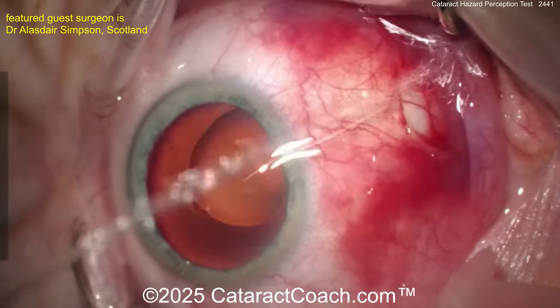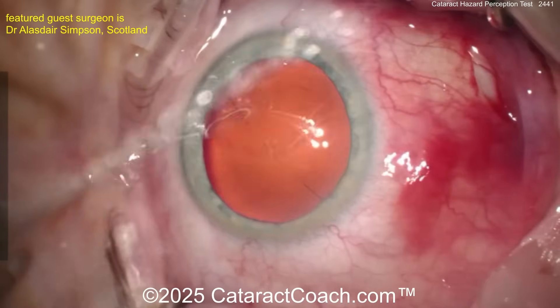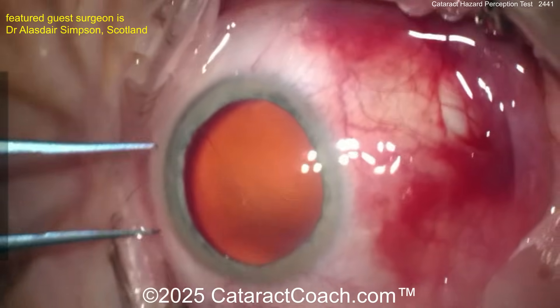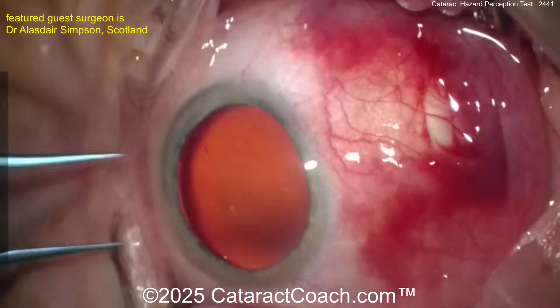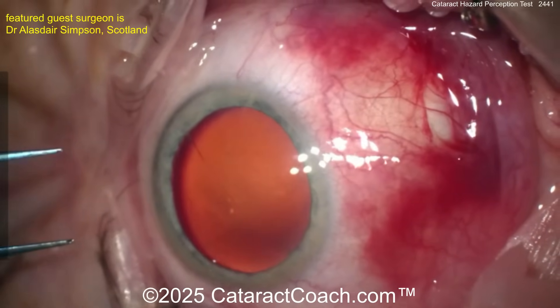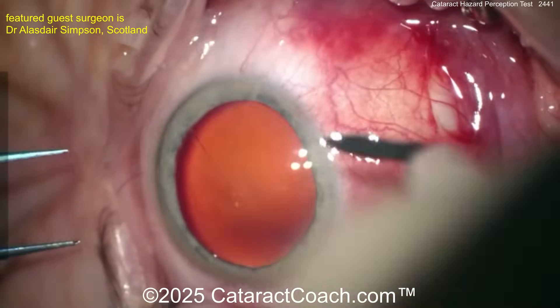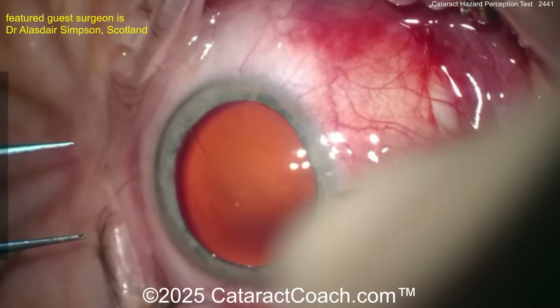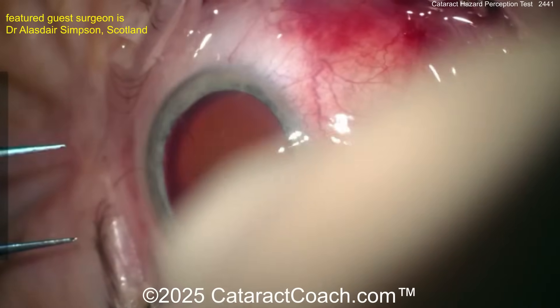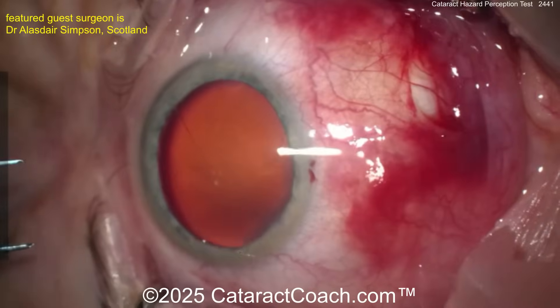You can see there's some sort of subconj — maybe some sub-Tenon's block — giving a little bit of subconj hemorrhage there. The patient's certainly not cooperating. There's the Bell's reflex; the eye is not in a good position, certainly not in primary. Trying to make the incision — whose hand is blocking the view? How are you making the incision without even seeing it? That's certainly an issue.